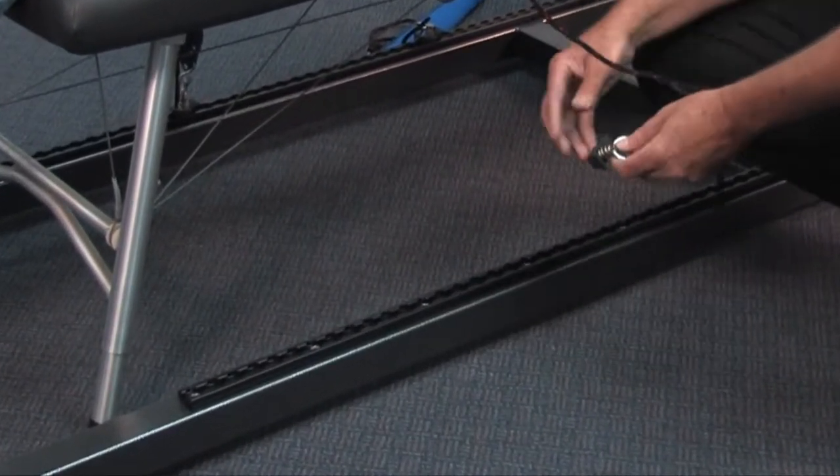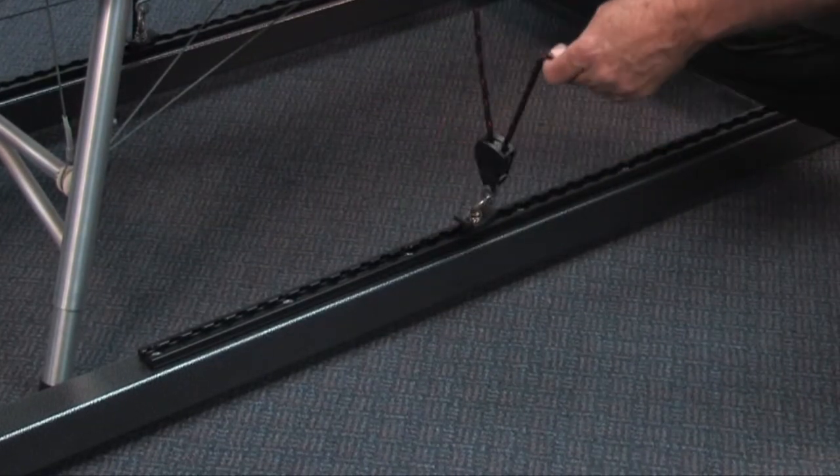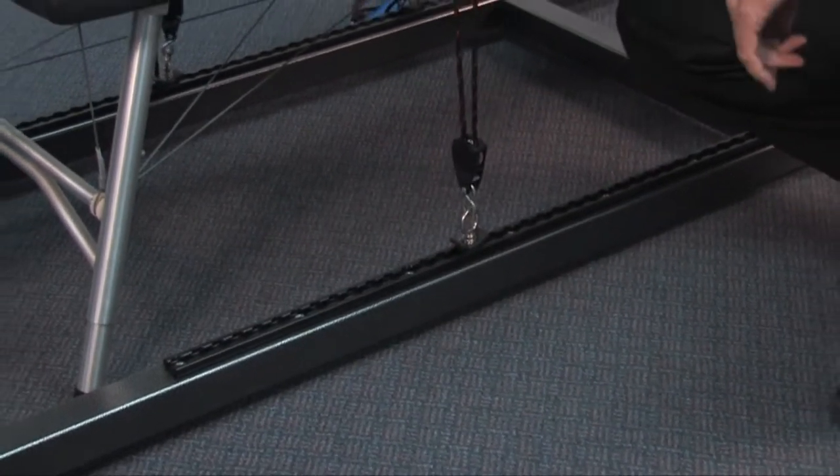The load locks will simply lock into your tracking, and then with the rope ratchet we can just tighten that right down.